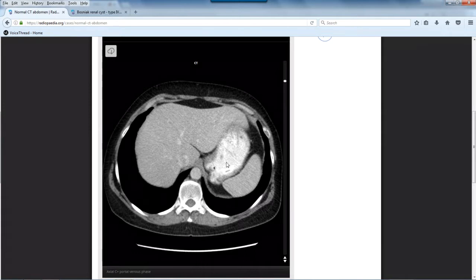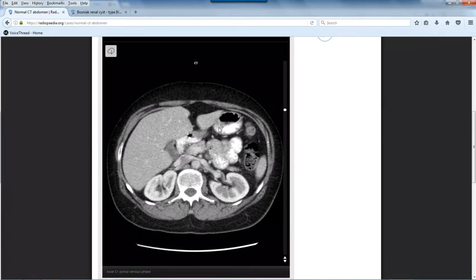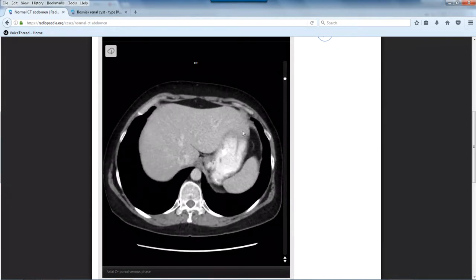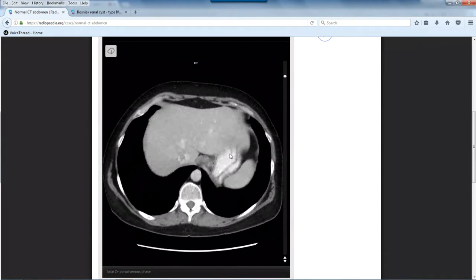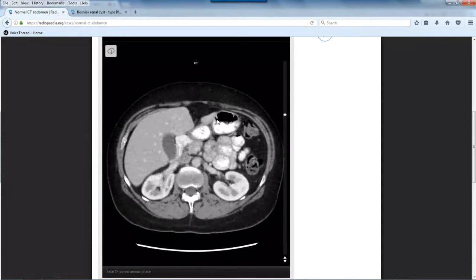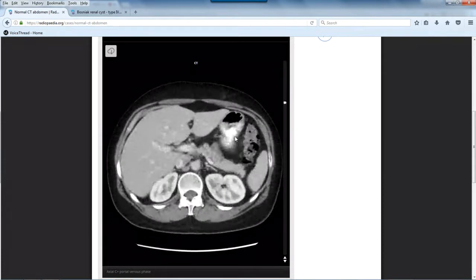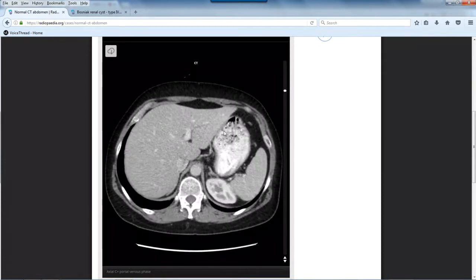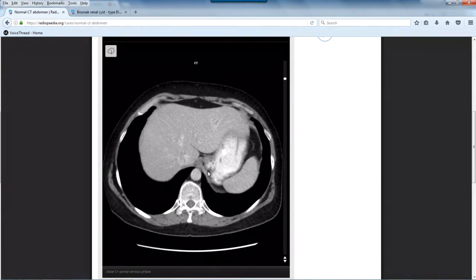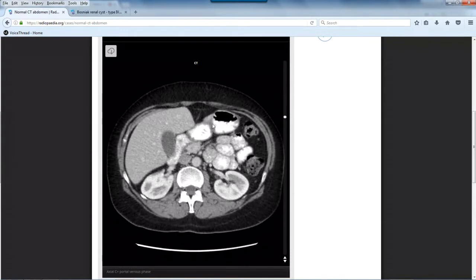So now from here down, until I get to the pylorus, which is about right here, everything is the body, and from about here up is the fundus. Okay, so fundus, body, pylorus. You should be able to tell me, if I'm in the middle of this, that that's the body of the stomach. If it's way at the top, you should be able to tell me that's the fundus. And if you're all the way down at the bottom, you should be able to tell me pylorus.